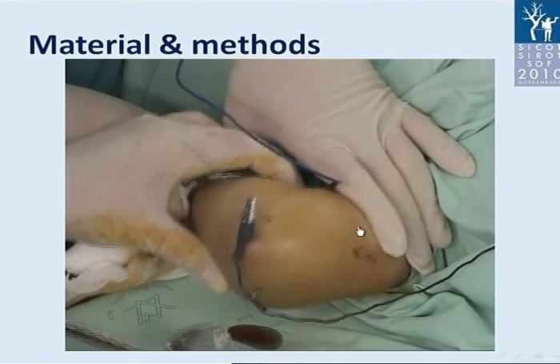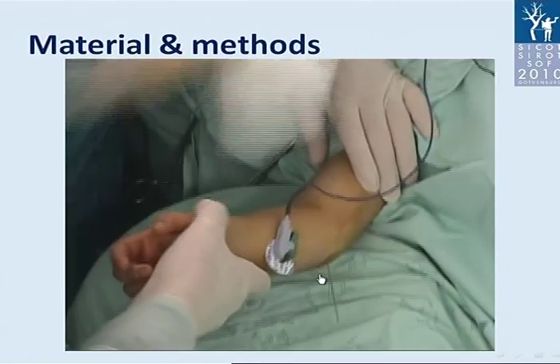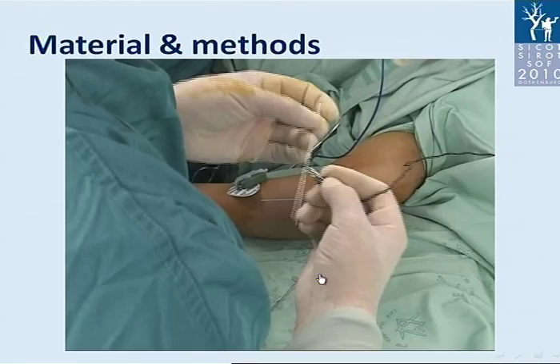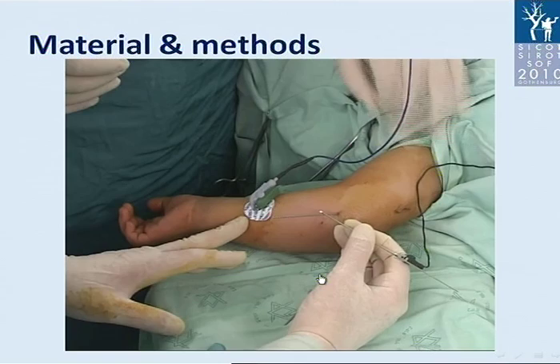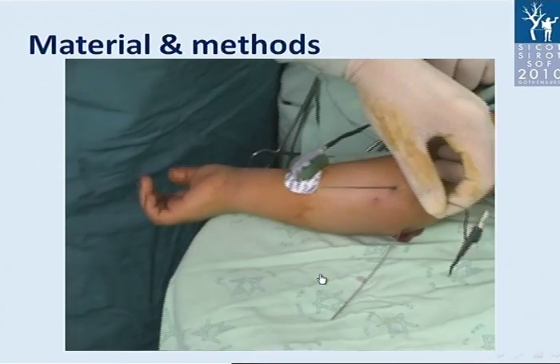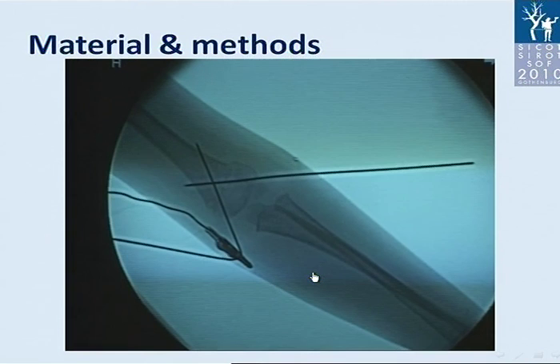The lateral side wire does not need any monitoring. We then check stability and reduction. You may see no stimulation on the wire placed through the medial side, and we confirm the position of the ulnar nerve — clear stimulation is present, so the ulnar nerve is free and untouched by the wire. X-ray control confirms anatomic reduction and stable fixation achieved.